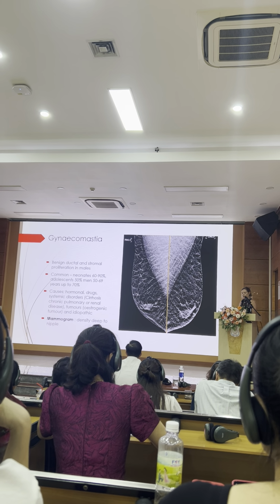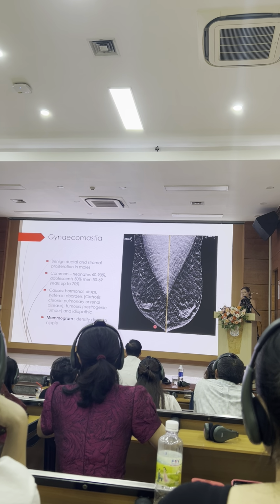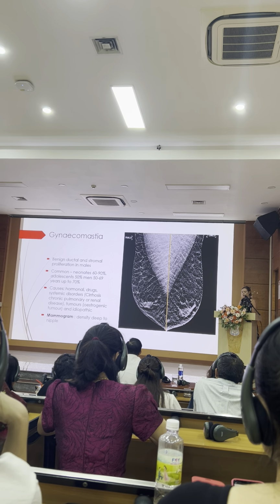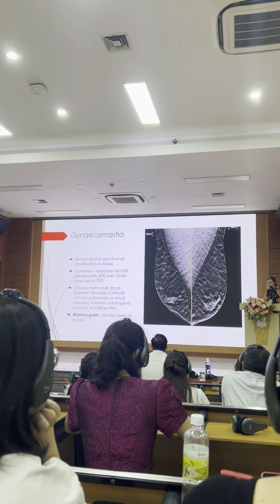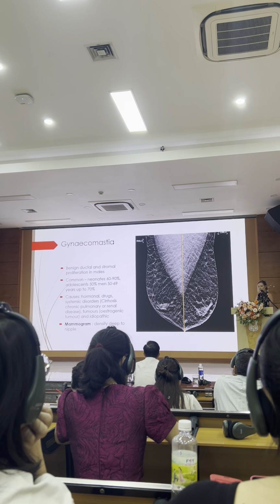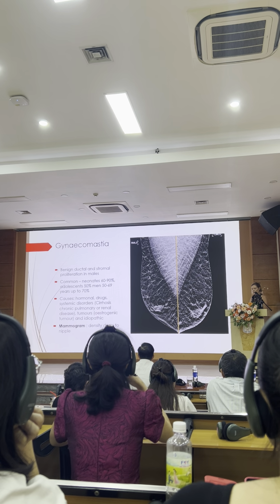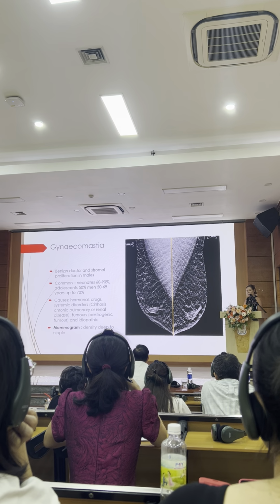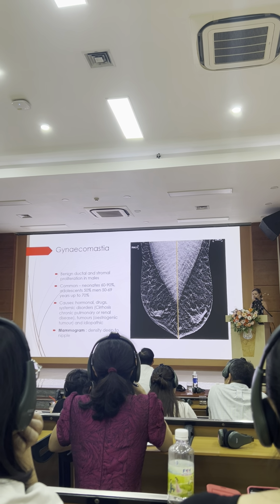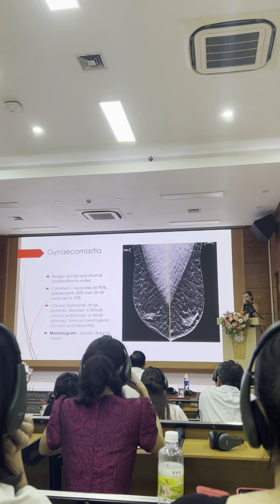On mammogram, it's just seen as density deep to the nipple. It can be asymmetric, bilateral. We don't routinely perform mammograms for gynecomastia. Sometimes surgeons in Australia request mammograms, particularly if they're considering surgical excision, which is just for the patient's sake. There's no need for surgical excision. We also perform them if the patient has a strong family history of breast cancer, or if they can feel a palpable lump.